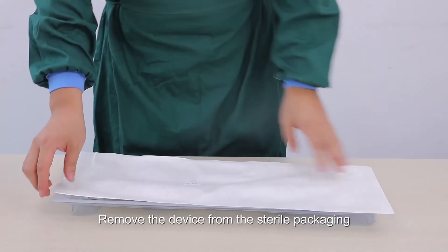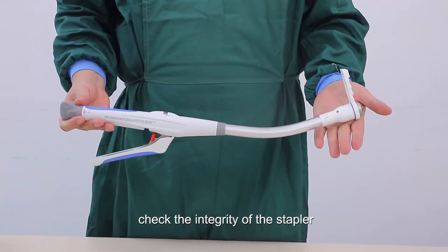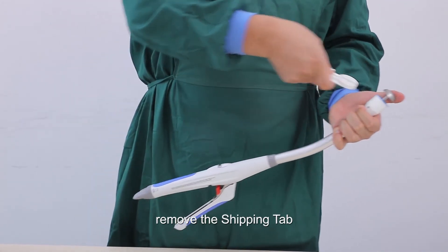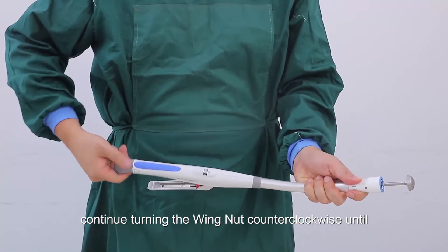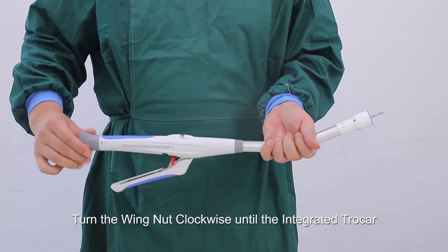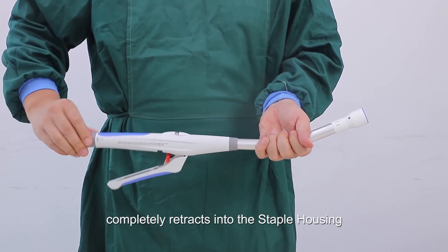To use the device: remove it from the sterile packaging and check its integrity. Turn the wing nut counter-clockwise to open the device and remove the shipping tab. Continue turning counter-clockwise until the orange band is exposed, then remove the anvil assembly. Turn the wing nut clockwise until the integrated trocar completely retracts into the staple housing.